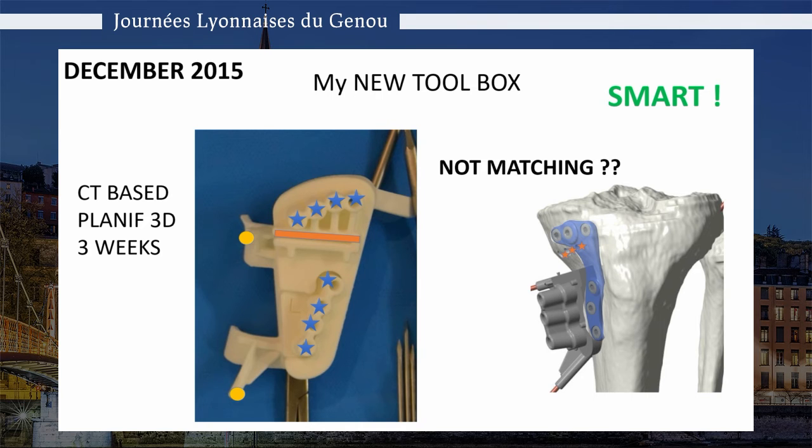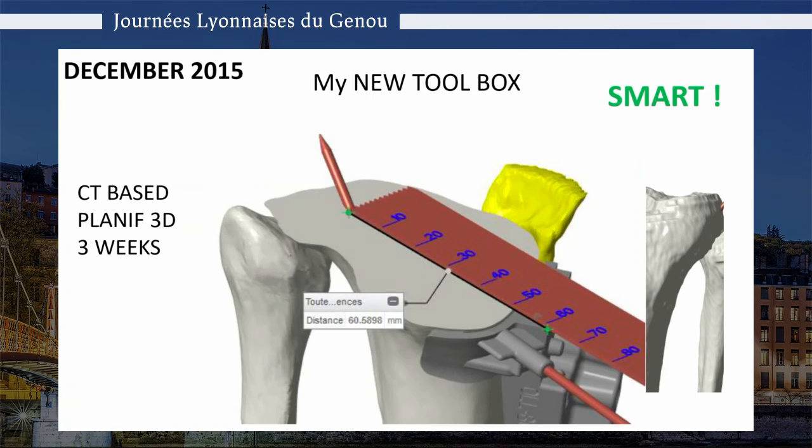And the reason why is that the correction needs to be performed before the holes are facing each other, and this is the beauty of the system. The correction is integrated in between those two maps: the hole you drill in the PSI and the hole you drill in the plate.